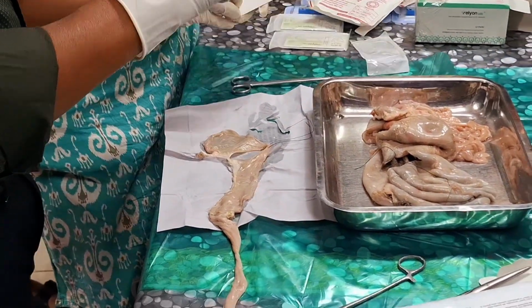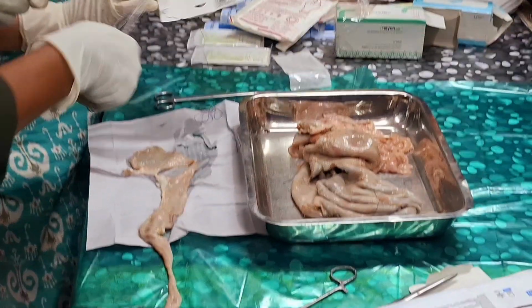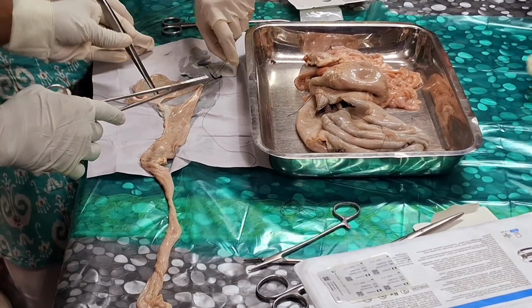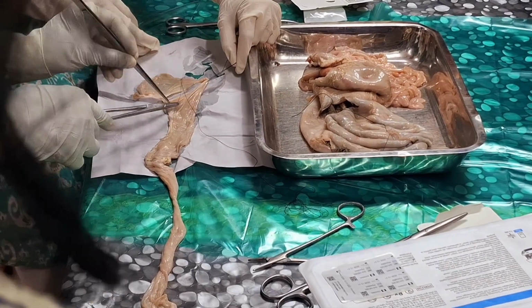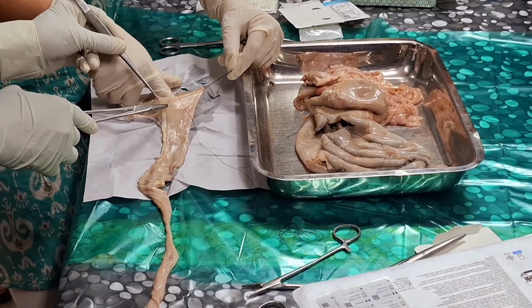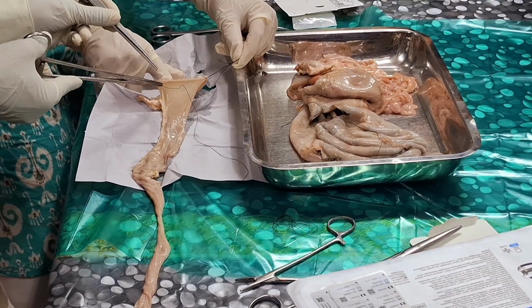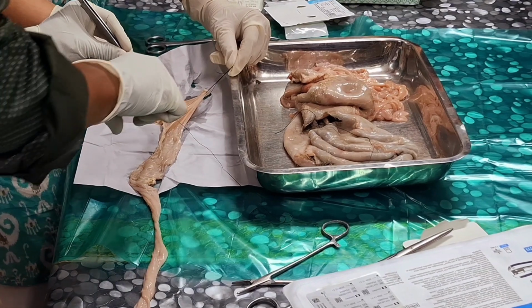When the mesentery is long, you are able to see both the anterior and posterior surface of the whole bowel easily.